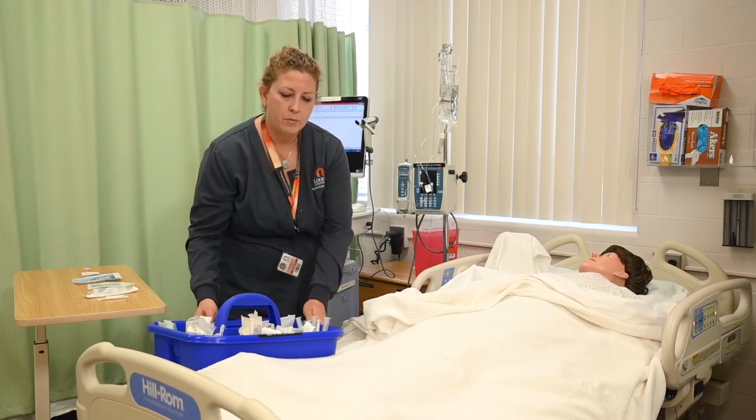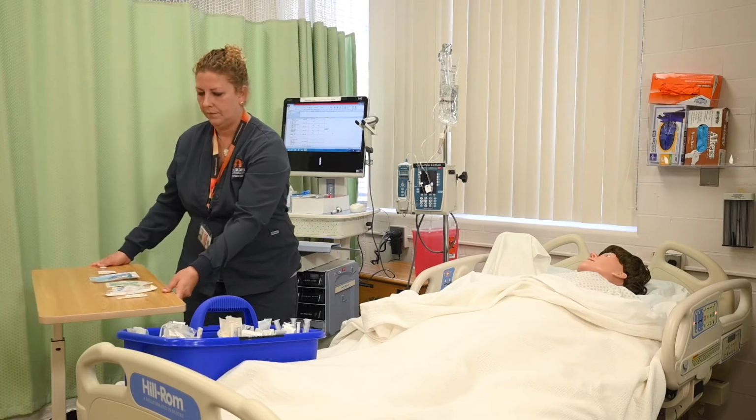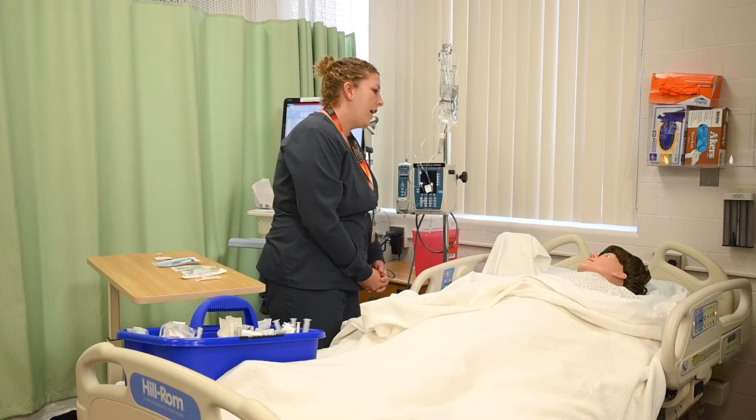Okay, I've raised the bed to a comfortable position. Verify any site restrictions such as mastectomy, AV fistula, etc. Is it okay that I use your right arm? You don't have an AV fistula dialysis catheter? You haven't had a mastectomy on the right side? Great.